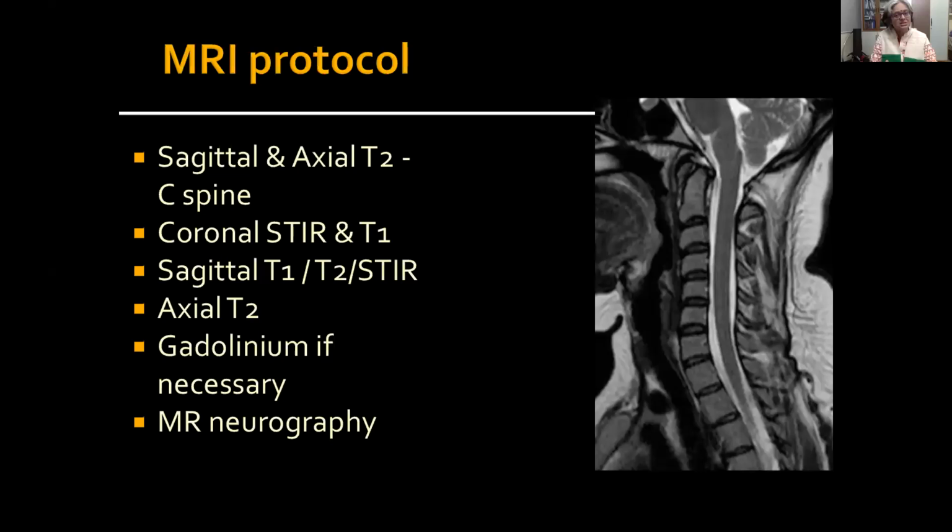Fancy imaging portion. We'll just look at the basics. So brachial plexus is not something that you would image every day, but it's something that you keep getting referrals for quite often. So first we'll look at the MR protocol that we follow, follow that up with normal anatomy, how the brachial plexus appears on MRI, and then go through the common pathologies.